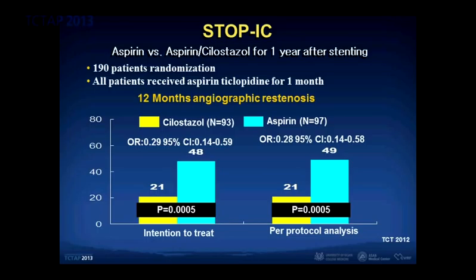The primary endpoint was one-year follow-up angiography, and all cases had angiography done. That's outstanding. The follow-up angiography rate was 84%. Extremely high. The measurement was independent core laboratory measurement by QVA, and there was significant restenosis reduction in the cilostazol arm. That's very exciting data. And the stent was the old Smart stent, all bare metal Smart stents. So consistent stent. Yeah. If you showed this with your new drug-eluting balloon or drug-eluting stent, you'd be the biggest sales. This is a salesman right here. We need to start using this drug more, John.